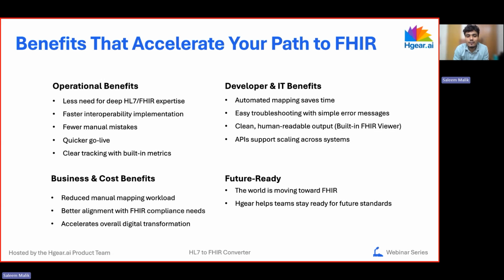And yeah, as I said, if you have to do everything manually, we will definitely be making mistakes. But here there are much lesser chances for making mistakes. As I said earlier, this mapping and all these HL7 to FHIR transformations are done based on the inputs provided by our clinical informatics team, developers, test engineers, and data services team. We have got the inputs from everyone and we have built the system. So there are very lesser chances for making mistakes. So if you get all these things going live, it's very easy, very simple, and you can quickly go live.